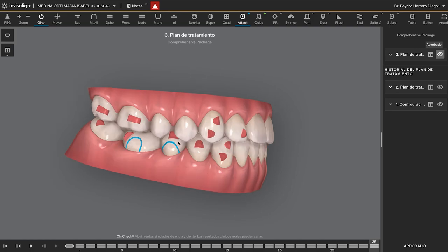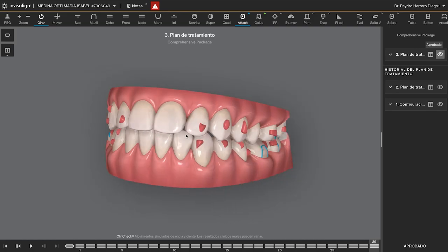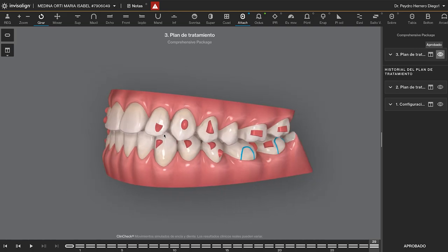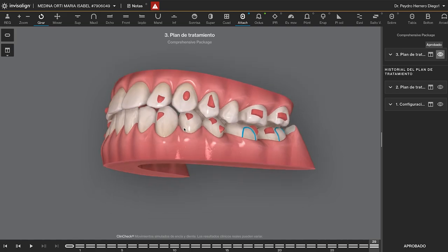The other attachments are optimized attachments. Today I will remove the optimized attachments and put conventional ones, because my protocol right now is to use conventional attachments.